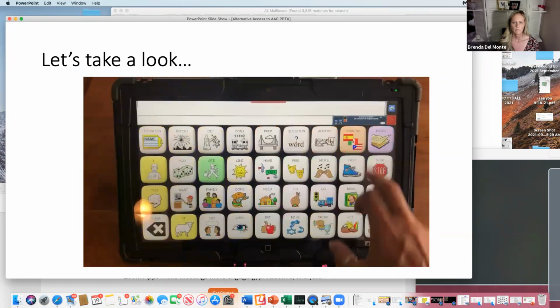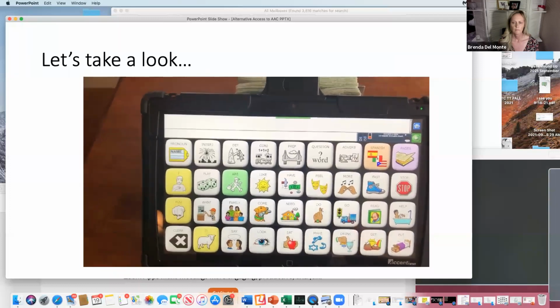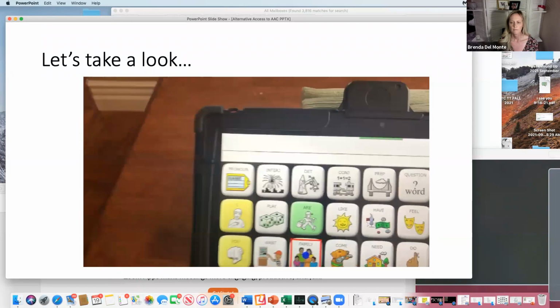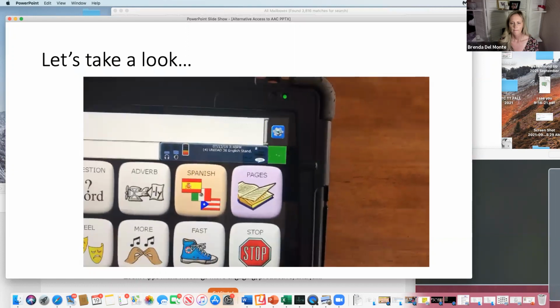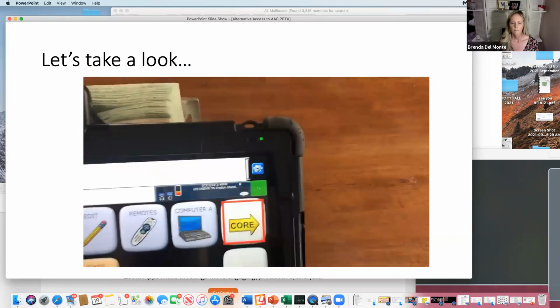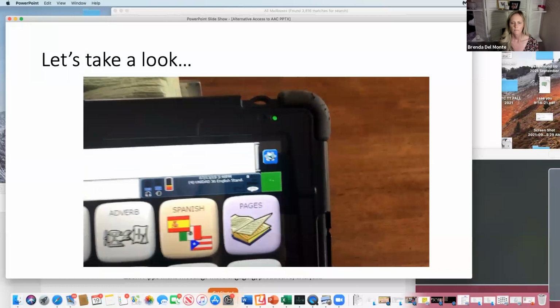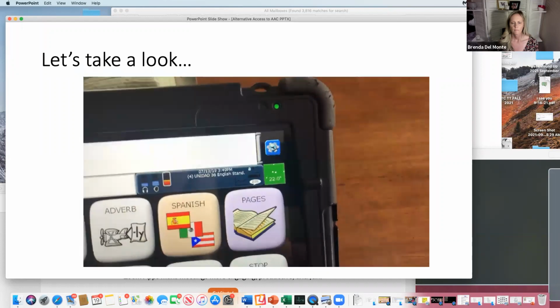So what we're going to do is show you that there's a box right here that shows when I turn it on, it's green, and you will see my eyes in that box, and you will see a number. And that says that the number is 17. And as I pull away, the number gets larger. So you want that number to be between 18 and 22. And you want those edge dots to be centered. That's kind of how you're always knowing where the eyes are.